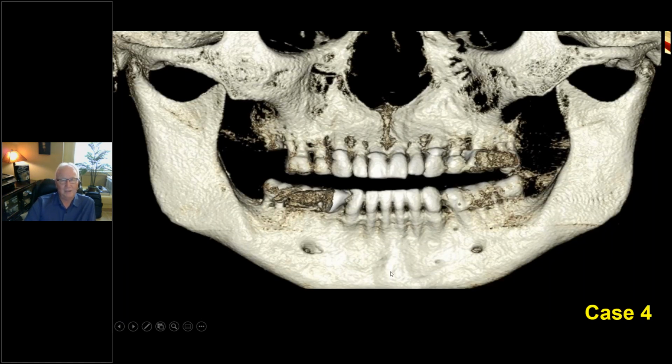All right, case number 4, again, improper placement. There's an implant here. I don't know if you saw it because there's a lot of scatter artifact in this image. There's some bone loss here and there. These are just areas where we didn't quite get all. If I did some image processing to make the bone fill in here, we'd have even more scatter artifacts.